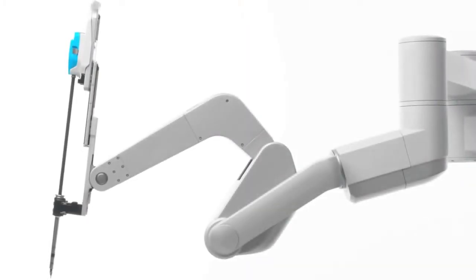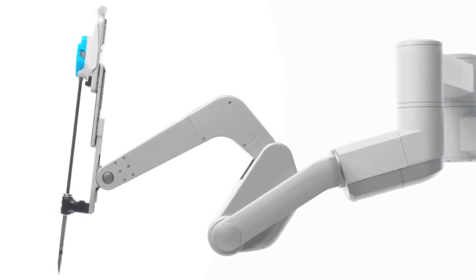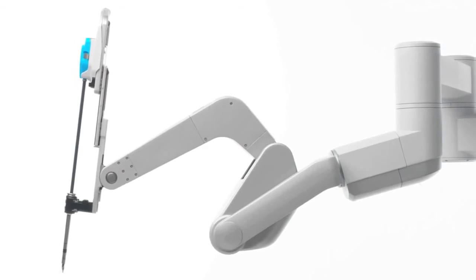One of the neat things about the robot is it can move and articulate in ways that the human hand cannot. With laparoscopy, which is also minimally invasive surgery, most of the instrumentation is on a straight stick, and it will allow grasping or cutting at the end like this, and also twisting at the wrist. The robot has an elbow as well as a wrist and fingers, and so we can move the instrument in ways that we can't move laparoscopic instruments. The surgeon can use that to finely dissect areas in funny contorted angles that he wouldn't be able to do any other way.